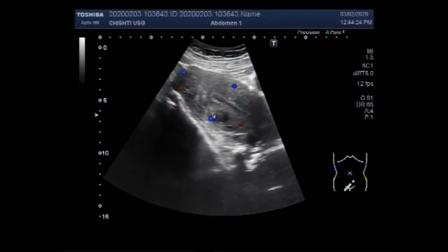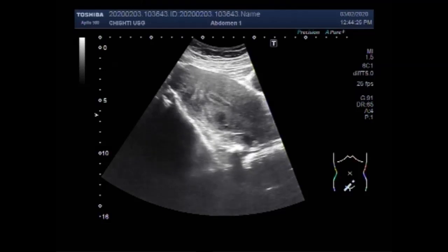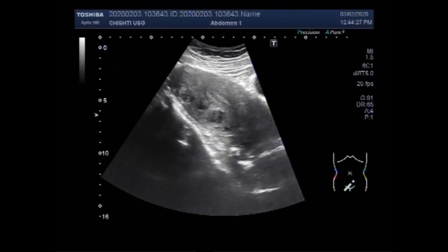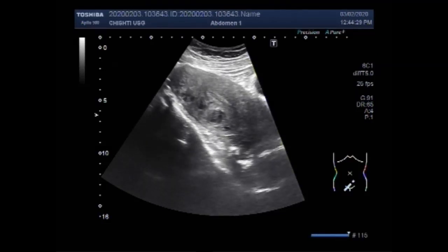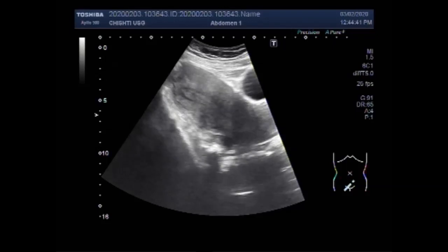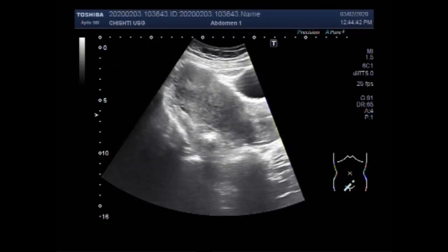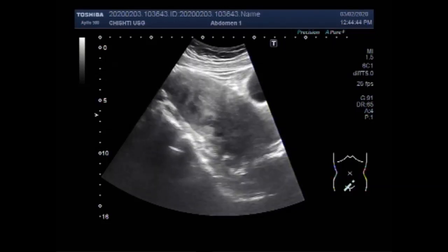Uterine fibroids are benign tumors that originate in the uterus. Although they are composed of smooth muscle fiber, as the uterine wall — that is myometrium — they are much denser than normal myometrium. Fibroids are usually round to oval in shape.